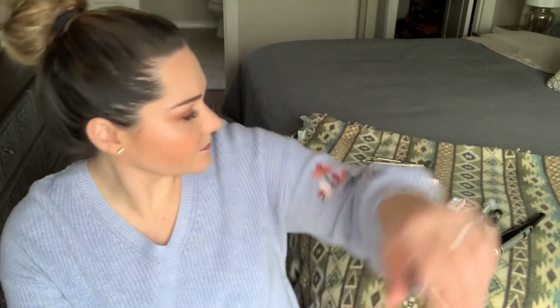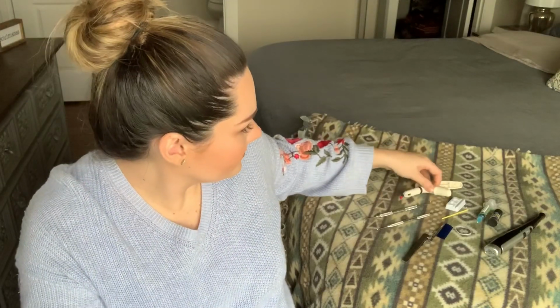So first, of course, he'll get the patient numb, and then when you're ready to start the procedure, you of course are going to be suctioning as the dentist removes any decay from the tooth. And then when he tells you that he's ready for the composite filling, after you put the matrix on, so again, for certain dentists, it's going to be different.